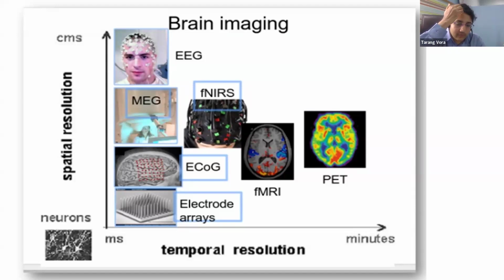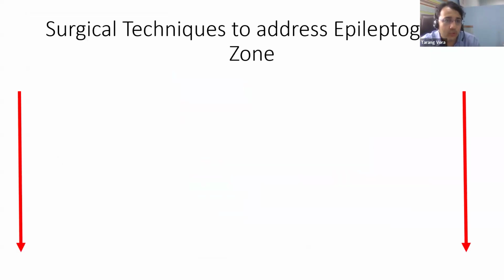So if you have an electrode somewhere, maybe F3, that is on the frontal region of the brain, which is showing an abnormal electrical spike during the seizure, it basically implies that the seizure area where it is starting can be in a range of approximately 10 centimeters in diameter around that, and that is a huge area, and we can't do surgery and resect 10 centimeters of a brain. So we need much more detailed information to find out where exactly the seizure is starting, and all of these modalities play their own role in us being able to zone in over there.